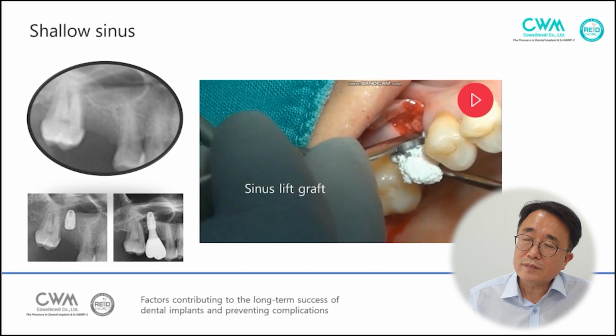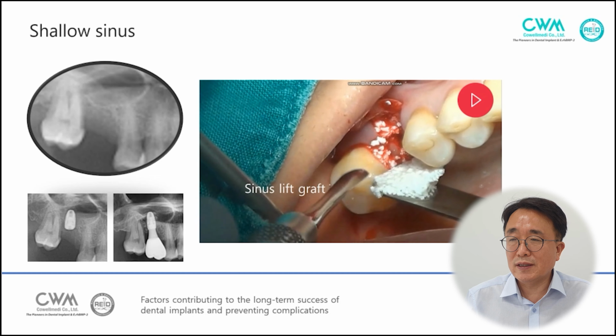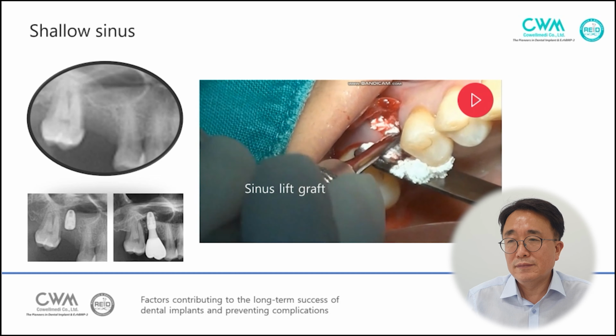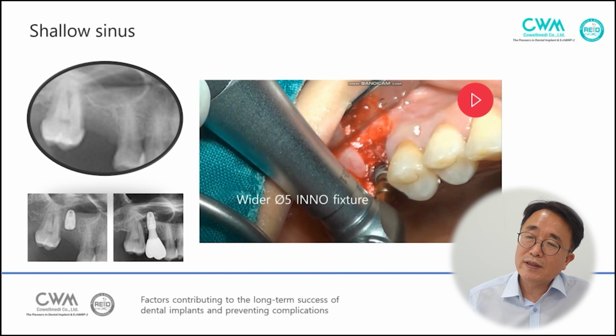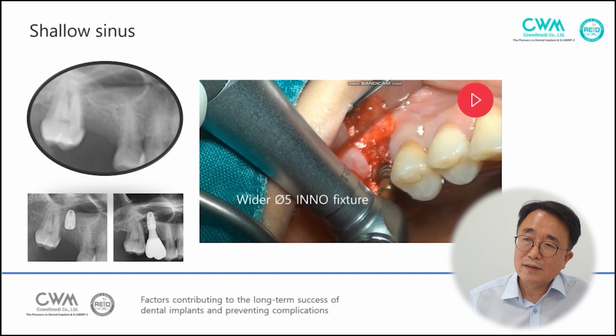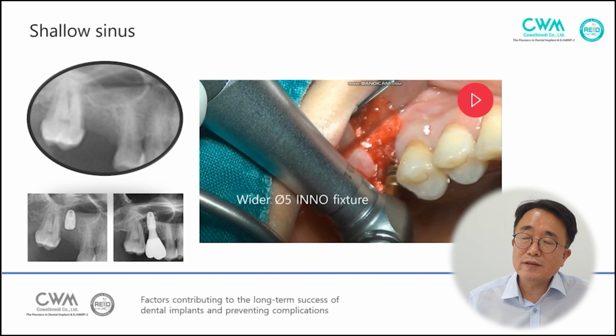And then sinus bone graft was done, and a diameter 5 implant was placed. So we could get initial stability.